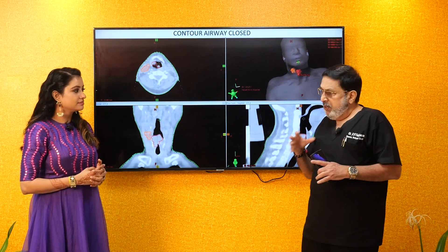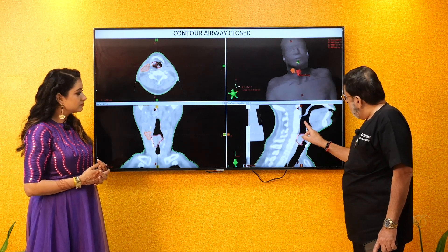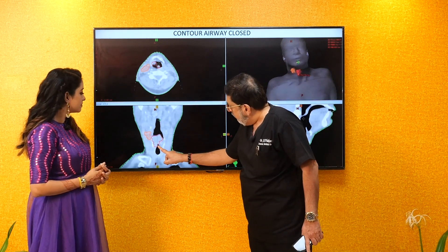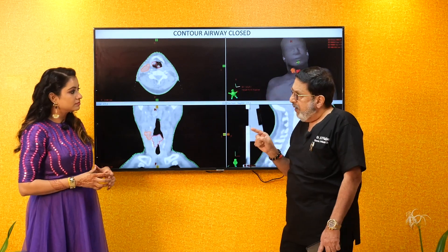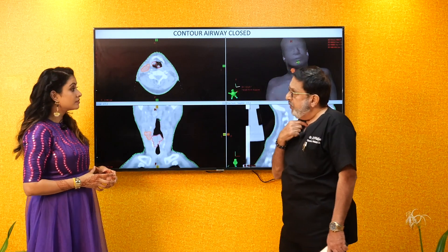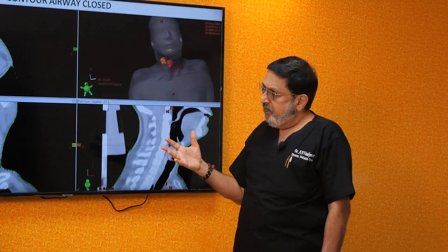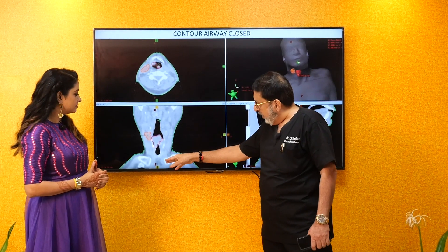This is basically a patient who came with a throat cancer — it is called a supraglottic tumor — blocking the entire passage. The entire passage is blocked. You can see the air cavity is totally blocked by the tumor. If the air cavity is blocked, that man can't breathe, and you require a tracheostomy — you have to put a pipe here and breathe through the pipe.